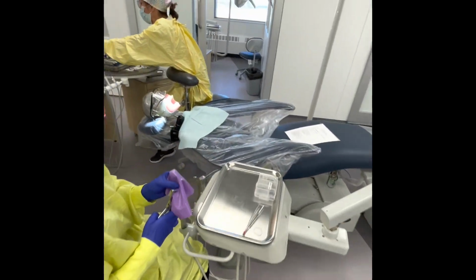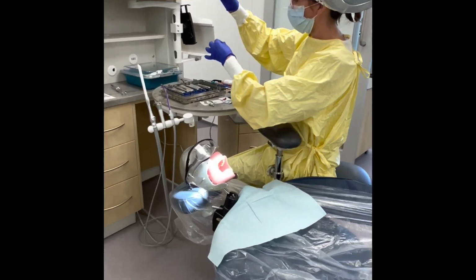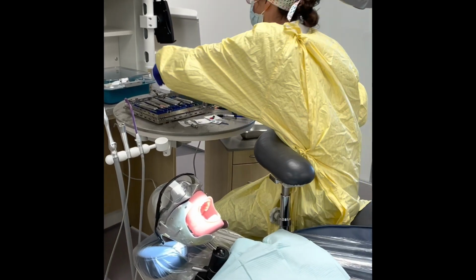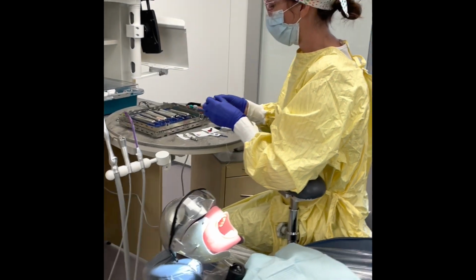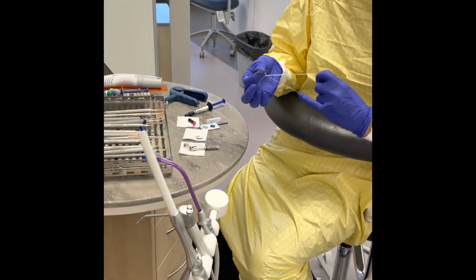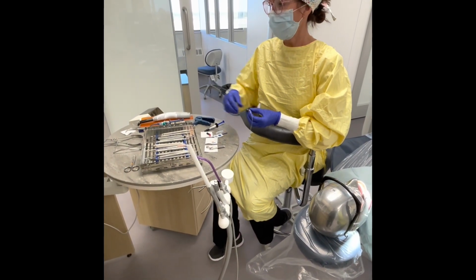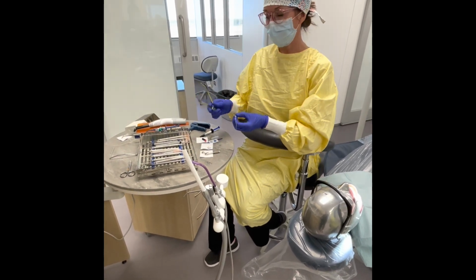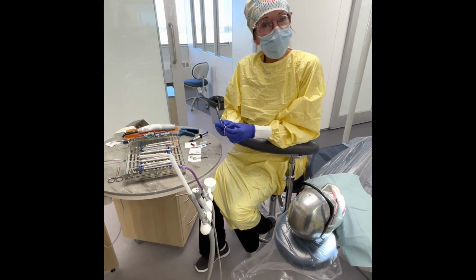While Amanda is punching her dental dam down, I'm going to put some floss on the clamp like you learned in DNTL 168. Safety floss is very important, and we must have it on anytime a clamp is placed into the mouth. So I know the first thing that Amanda's going to do is put her clamp on the tooth.